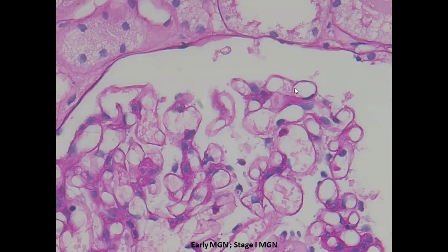Compare the thickness of the glomerular capillary wall with the thickness of the tubular basement membrane. If it is very similar, it is not significantly thicker. If the thickness of the glomerular capillary wall is more than the tubular basement membrane, then you raise the possibility that most likely you are dealing with membranous glomerulopathy or membranous glomerulonephritis. This is a morphological suspicion based on which we say, yes, it looks like membranous. Many times, in early membranous, there will not be any significant thickening of the glomerular capillary wall, and it will look like a normal glomerular morphology.